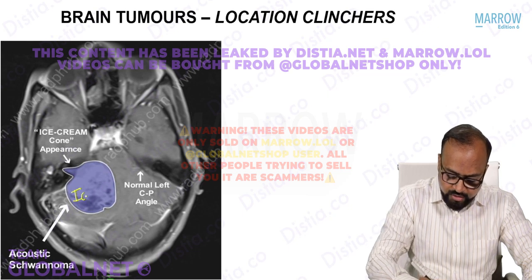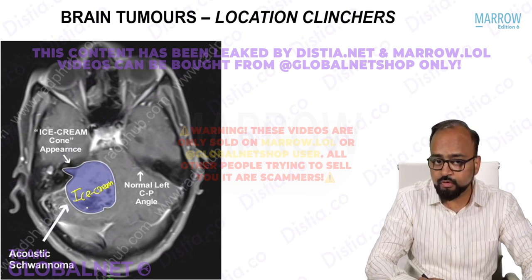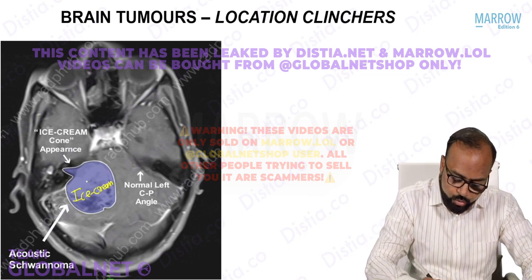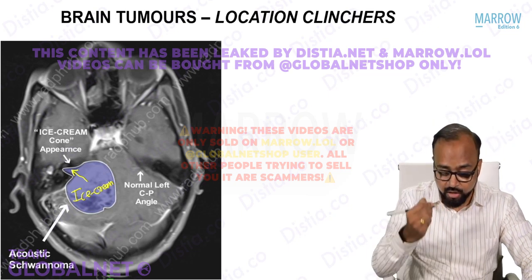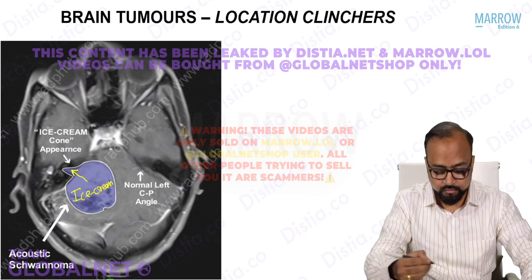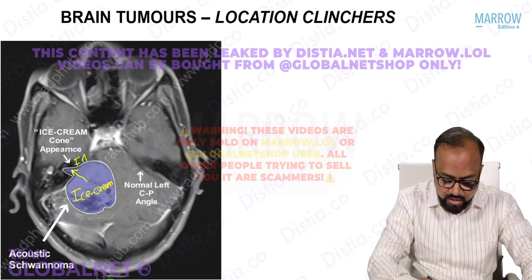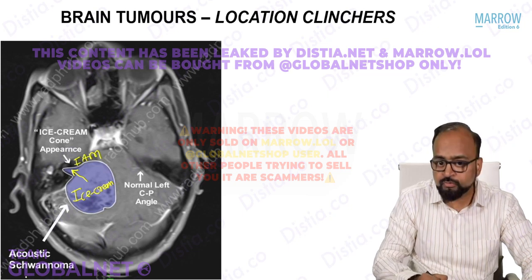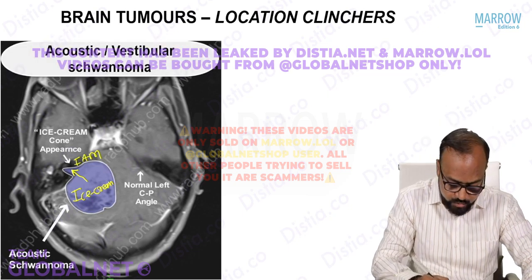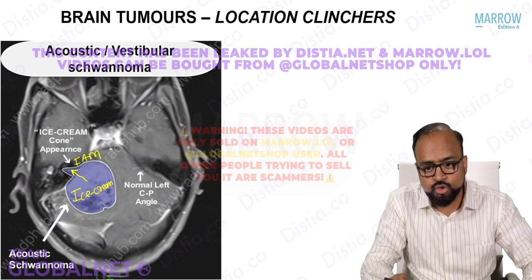See, the chunk of the ice cream is formed by the mass bulk of the tumor within the CP angle, but can you see the cone is formed by a small extension of this particular tumor along the vestibular nerve in the internal acoustic meatus. So this is what creates the ice cream cone appearance typical of an acoustic schwannoma or a vestibular schwannoma.